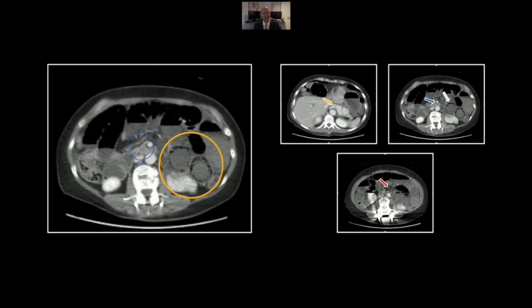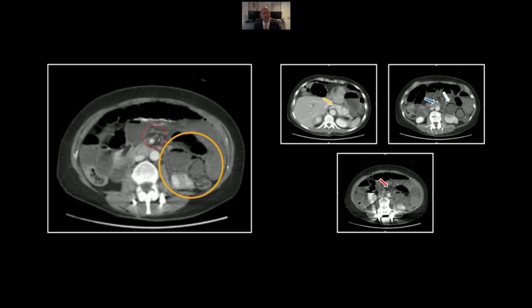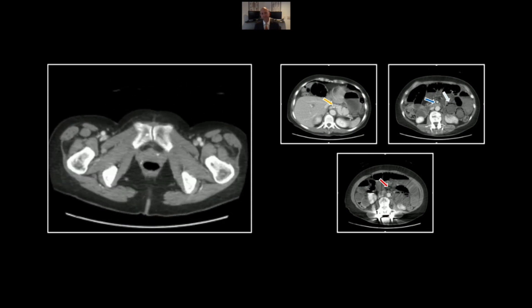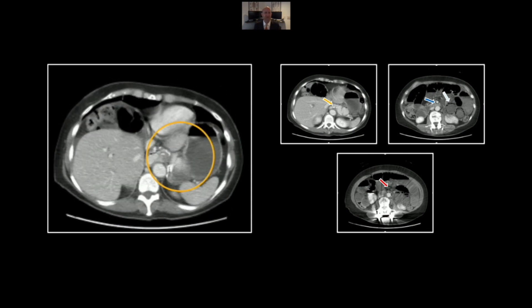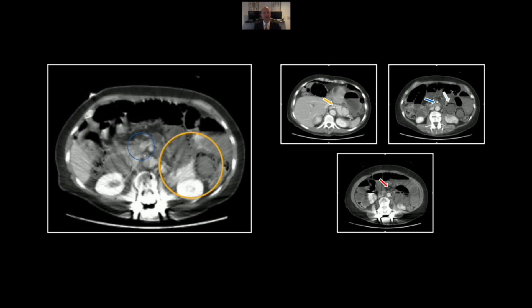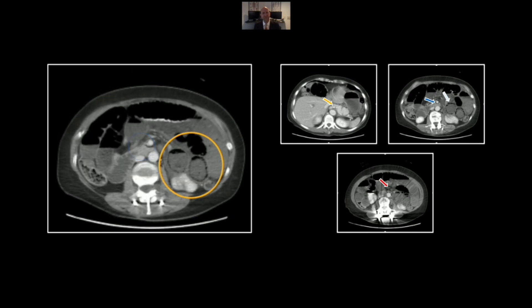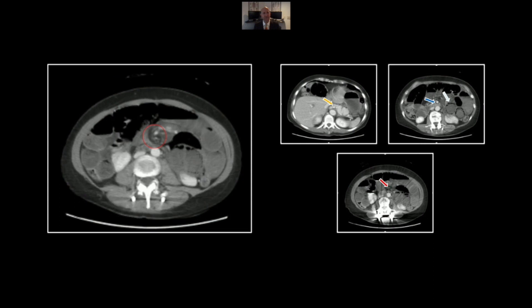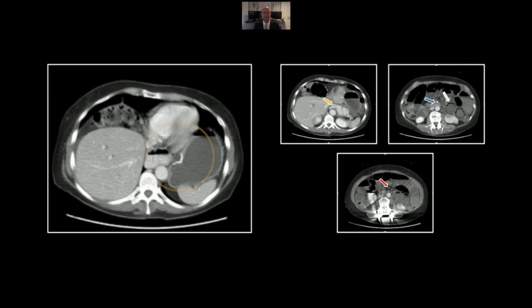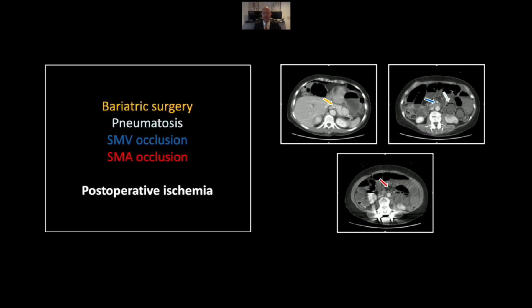Watch the superior mesenteric vein vanish and then the superior mesenteric artery vanish. You've got a good gastric staple line with passage of contrast into the small bowel loop, but pneumatosis in the left abdomen and vascular occlusions centrally — a very nice example of a postoperative Peterson hernia with volvulus and obstruction of the superior mesenteric vessels.